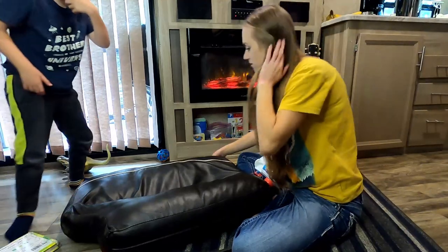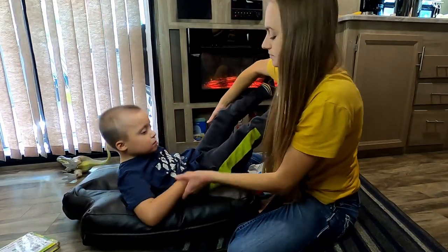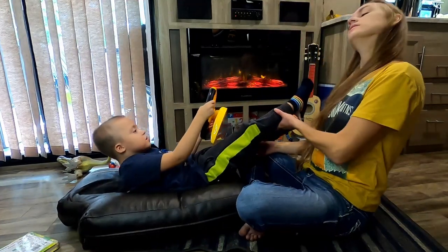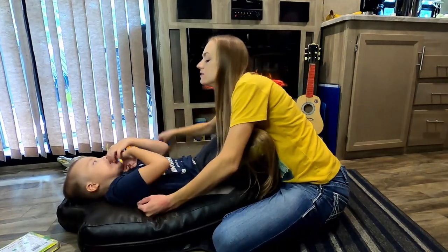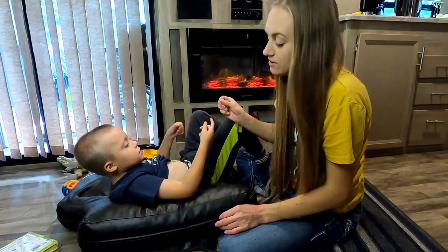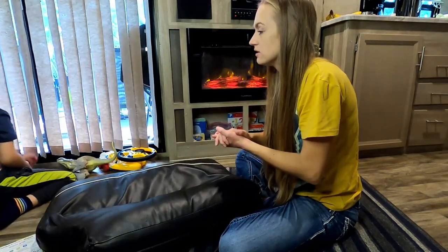Okay, now you need to come here. Are you going to sit? Hold that. All right, lay down. Now we've got the button here, and it's still in there, obviously, but we need to get it out. Sometimes you have to put a little bit of force into it, not a lot, but it takes a little bit to get it out. But I need you over here.